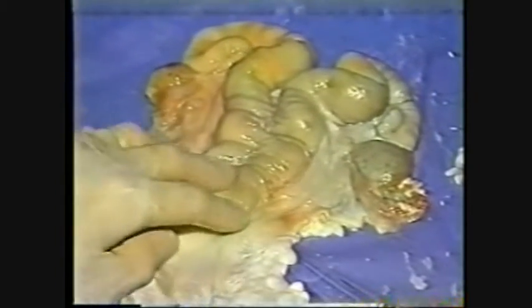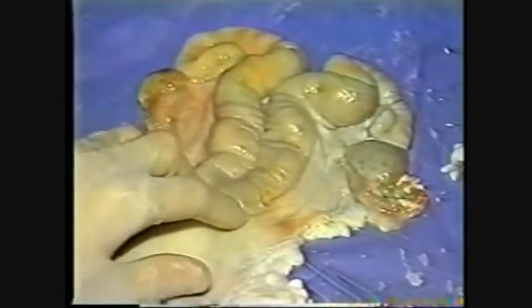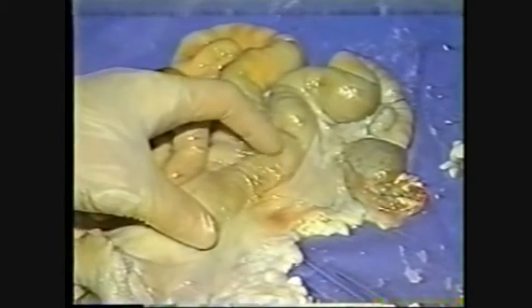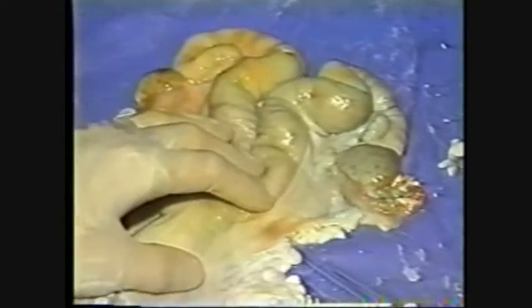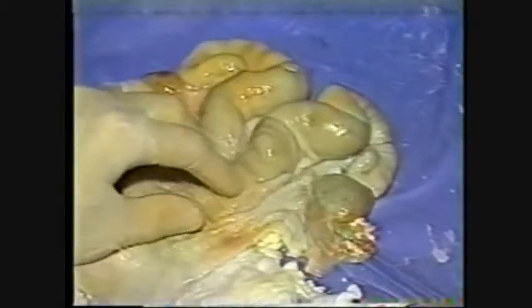You feel that it has started. Here's the external palpable bifurcation right here. We're feeling down with our middle finger. Feel the split, and the catheter tip happens to be right here at this point. It's already started to advance down the right horn. So you just pick up the horn gently, trap it against the internal cavity wall inside. Lock that head a little bit.